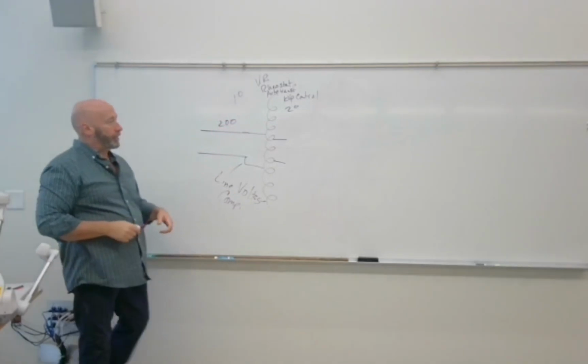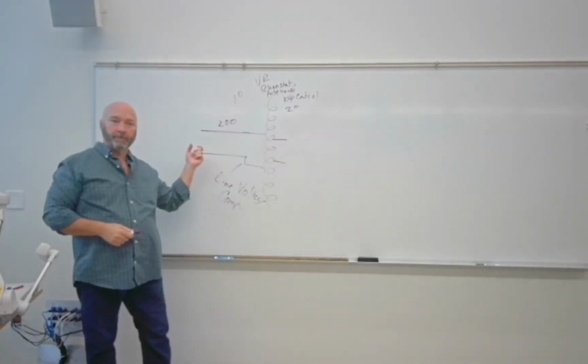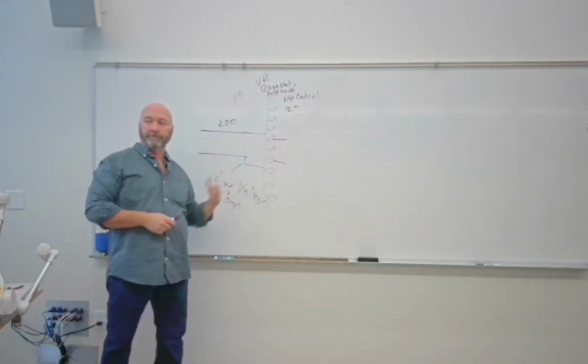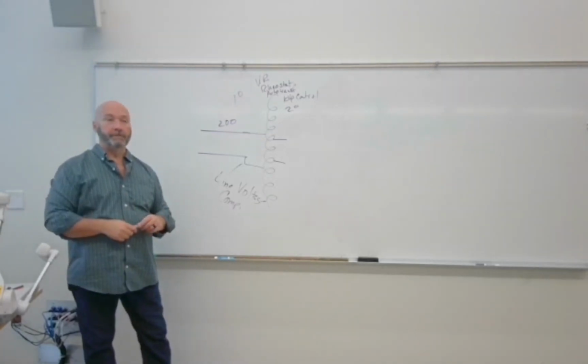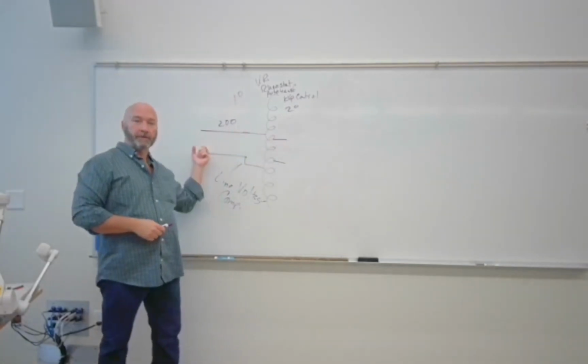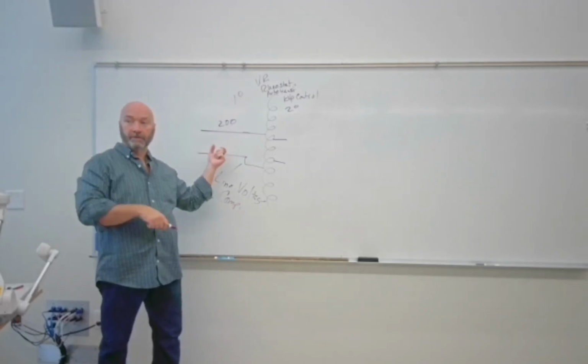And I incorporate 1/4 of the turns on the secondary side compared to the primary side, then what is my voltage change? It's a direct relationship. I use 1/4 of what I had over here. Our voltage is going to go down, right?